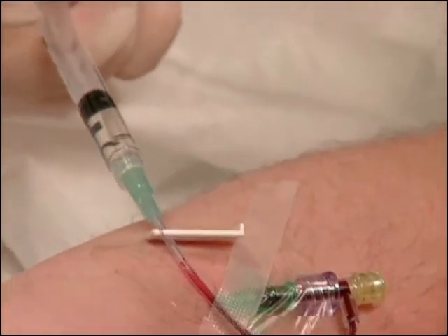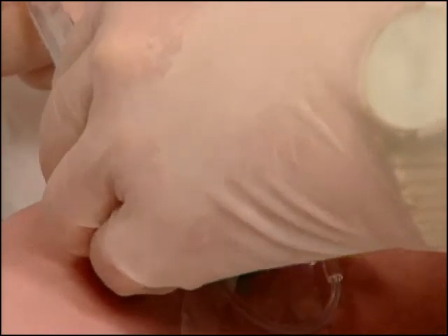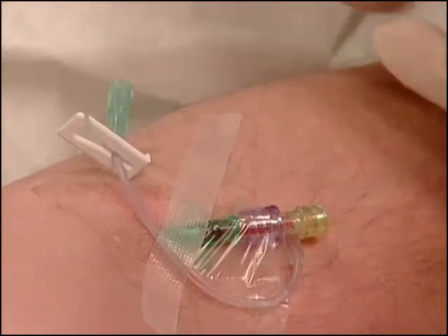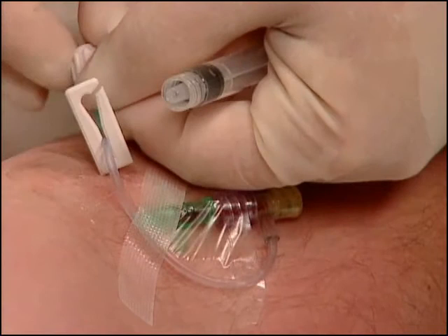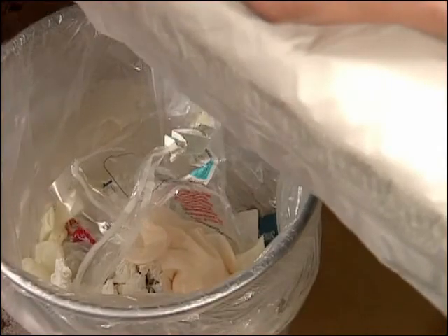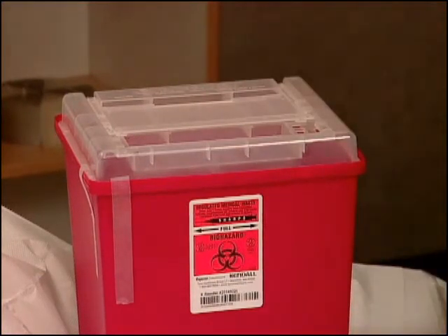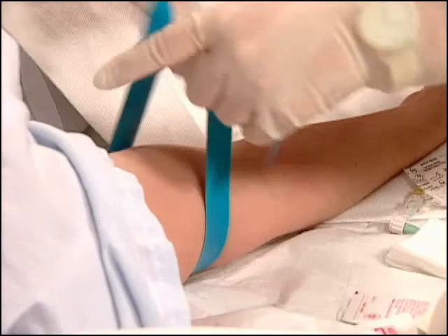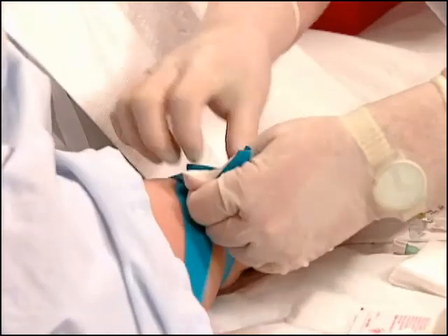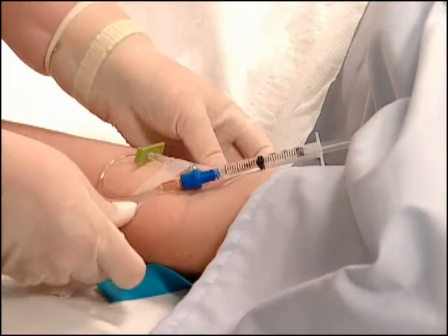Check the site for swelling, pain, redness, or tenderness. If any of these signs are found, immediately remove the catheter and dress appropriately. Remove and dispose of all used equipment. Place any blood-spattered items in the appropriate biohazard containers. Regardless of where you work, whether in hospital or in the field, the technique of IV insertion requires practice.